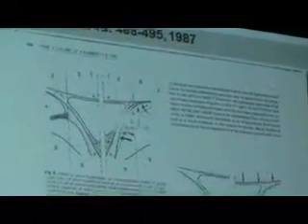So if somebody comes in with this room, this room, this room, and it's all arthritic, I'm not going to have the same clinical success, and I'm a happier chiropractor and clinician when I see this bulge, this bulge, this bulge. I have a fighting chance. Chances are I'm not going to be able to just affect the facet. If that facet is so huge and hypertrophied and crushing into that, it's giving an intermittent compression. My clinical success is less than if there is soft tissue involvement that I can get to through three-dimensional decompression with the right movement.